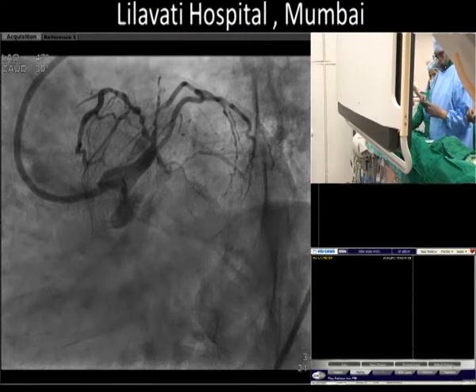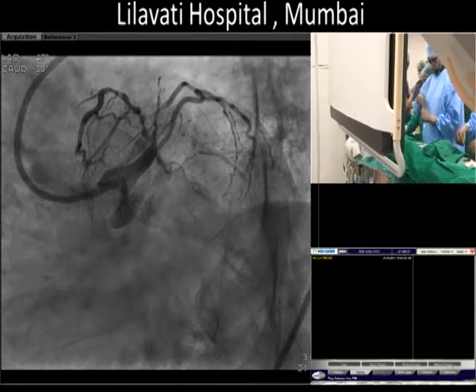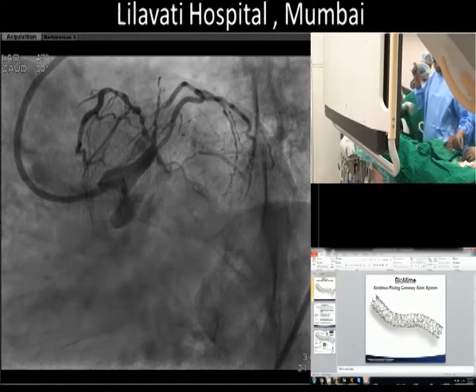So here you'll put a 2.5 Biomime. Show the compliance. 29, 24. Yes, Manish, 24. 24, okay.